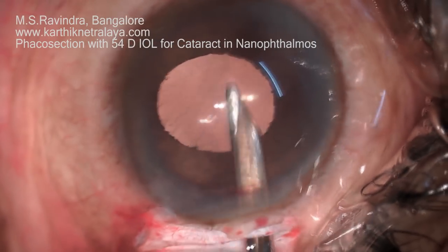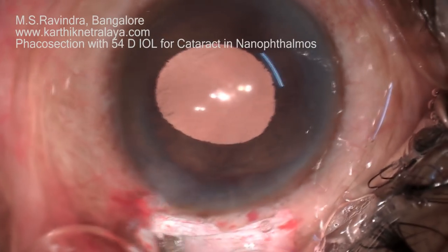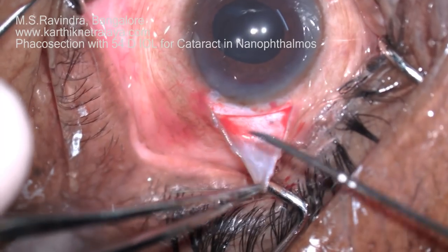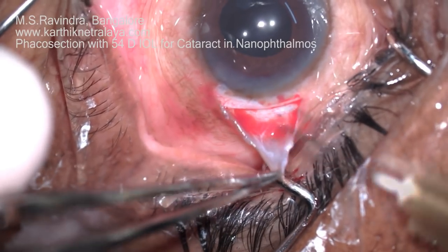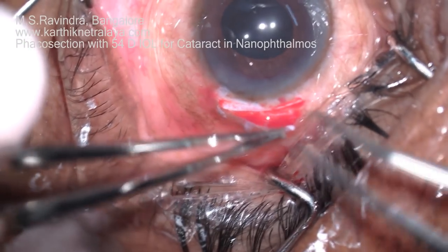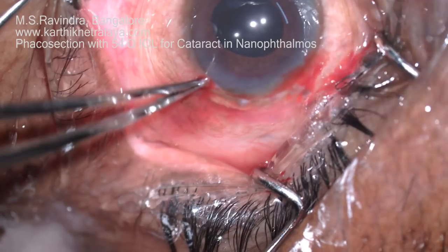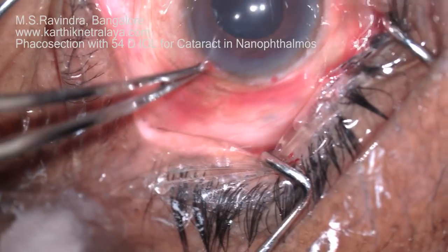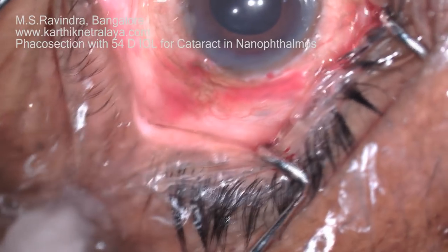The viscoelastic is completely aspirated from behind the lens, from the anterior chamber, and from the angle region, so that a post-operative pressure spike does not occur. There is only one entry into the eye, which is sealed using fibrin glue components A and B. The eye is kept open and medications can start right away. This is a very rewarding surgery for nanophthalmos — risk-less, and patients are extremely happy with the results.